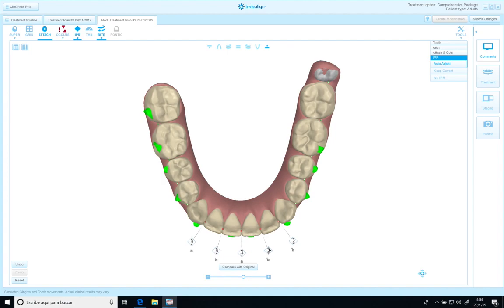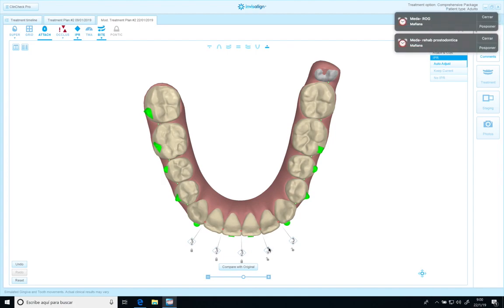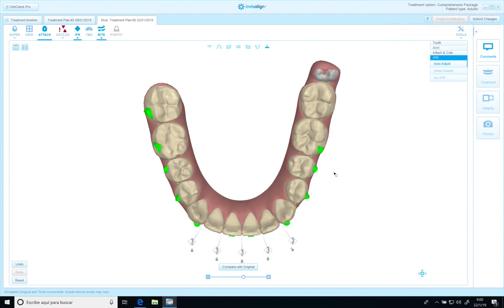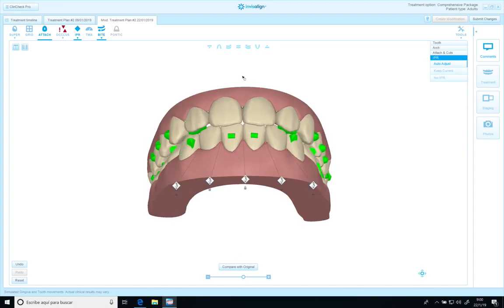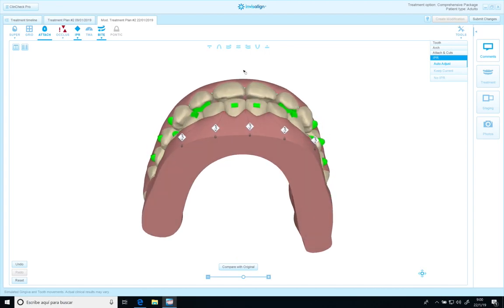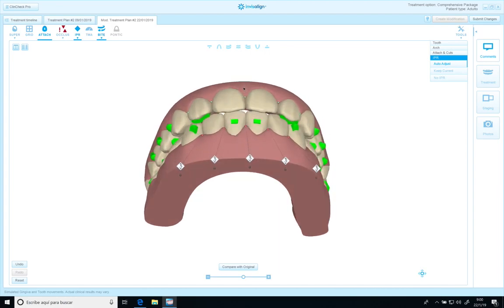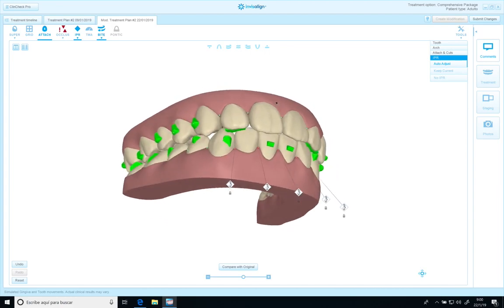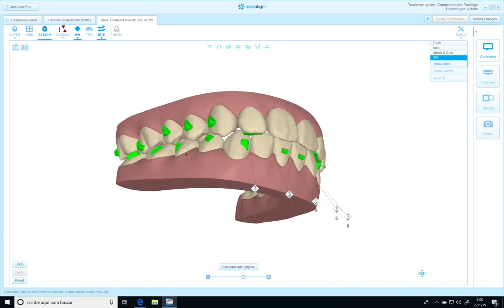I will increase a little bit the final overjet. So we check now, we have more overjet, which is what I want.